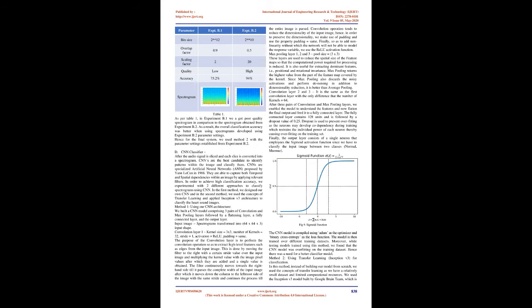The size and shape of the windowing slices can be varied, providing us with tunable parameters for our spectrogram image. The different parameters affecting the spectrogram's precision are FFT length, window type, hop size, window length. If we use a shorter time window, it gives better timing precision but deteriorates frequency precision and vice versa. The FFT length determines the amount of spectral oversampling.